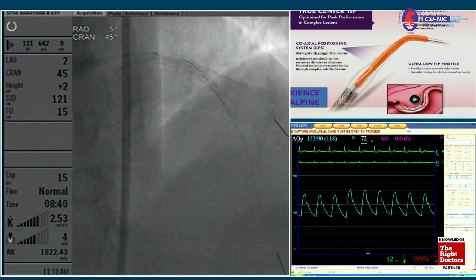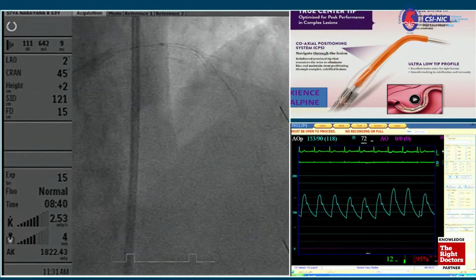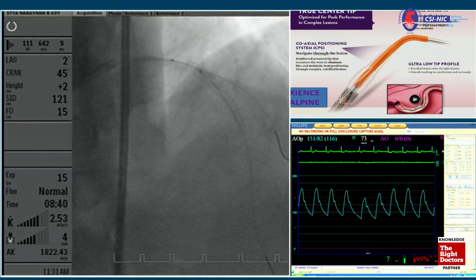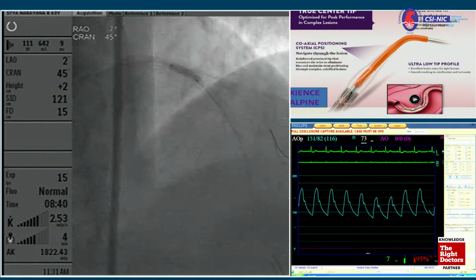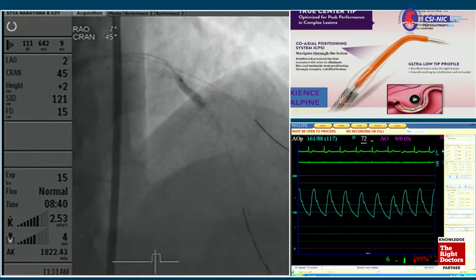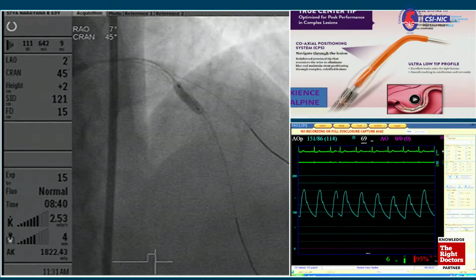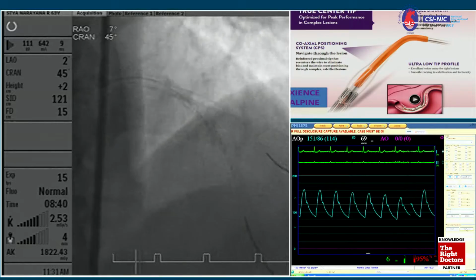Now what we did was we took a short 3.0, I think 15 or 10? 8. 8, oh, it's 8. And we took it up to do a POT. Here you see the POT. Next. Now it's better expanded here, but still not fully. And then we dilated the tighter part. Next, please. You can see the same here, also not fully, but better expanded. And you see quite a good result.